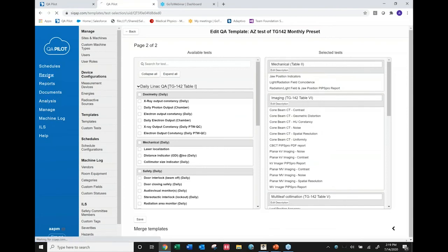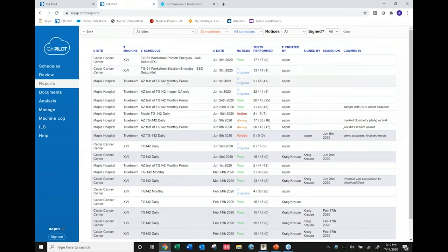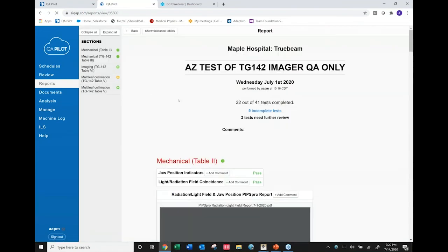Actually, back into review, I do want to show you one more thing here, which, as I mentioned, one of the newer things is our TG50, not TG51, but the PIPS Pro connection. And that is something that is in here as well. Probably actually easier to go into reports, see what I was doing. So I did my Imager QA only. It's in process. Let's just click on that and take a quick look at what that looks like.